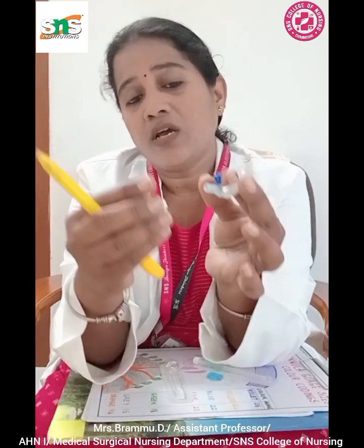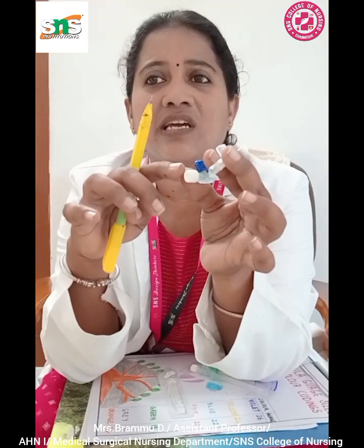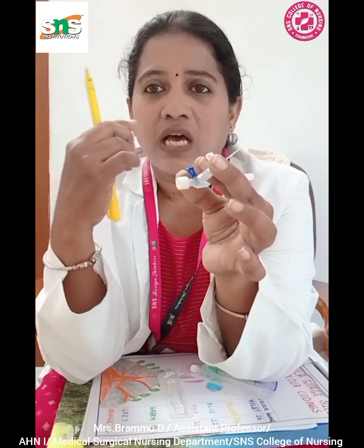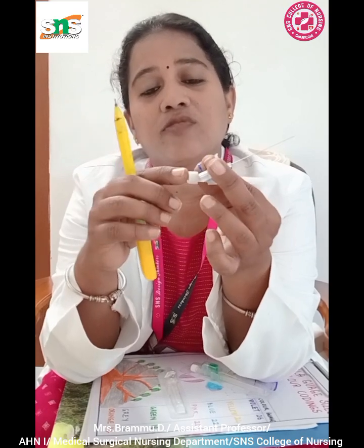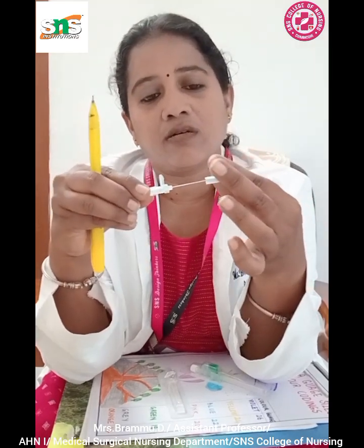When the patient is on a blood transfusion, medications, or IV fluids, we always open this port, and after administering into the patient's bloodstream, this hub is closed with the help of the luer lock plug. This plug acts as a tight, leak-free seal, preventing inadvertent disconnections during medical procedures. When we need to mobilize or transfer the patient, we close this with the luer lock plug and then transfer, in order to prevent leakage of blood from the IV line.